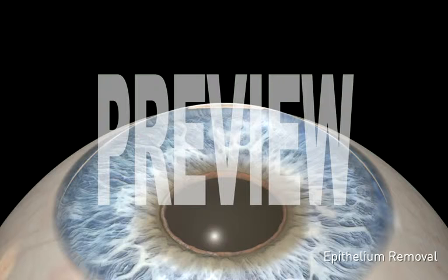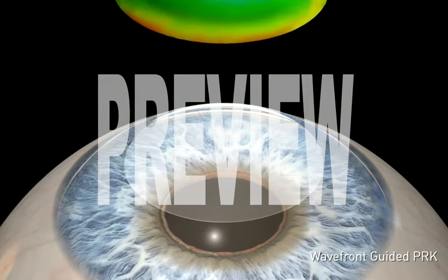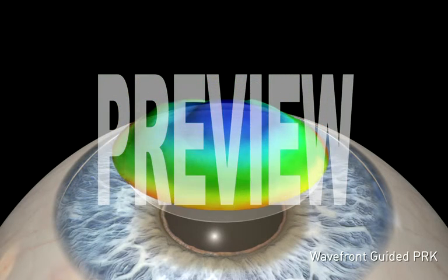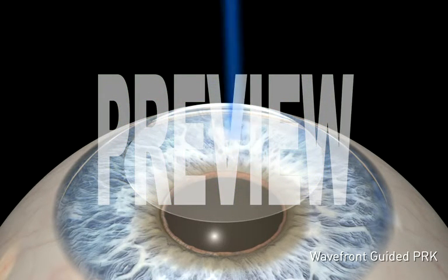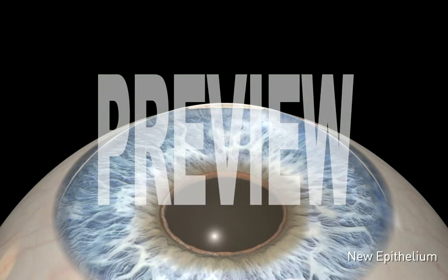After the eye is completely numbed using eyedrop anesthesia, the epithelium, or thin layer of protective skin covering the cornea, is removed. Using the 3D wavefront map representing your eye's unique visual distortions as its guide, the laser precisely removes the corneal tissue necessary to correct your vision. New epithelium grows back over the treated area, usually within three to seven days.